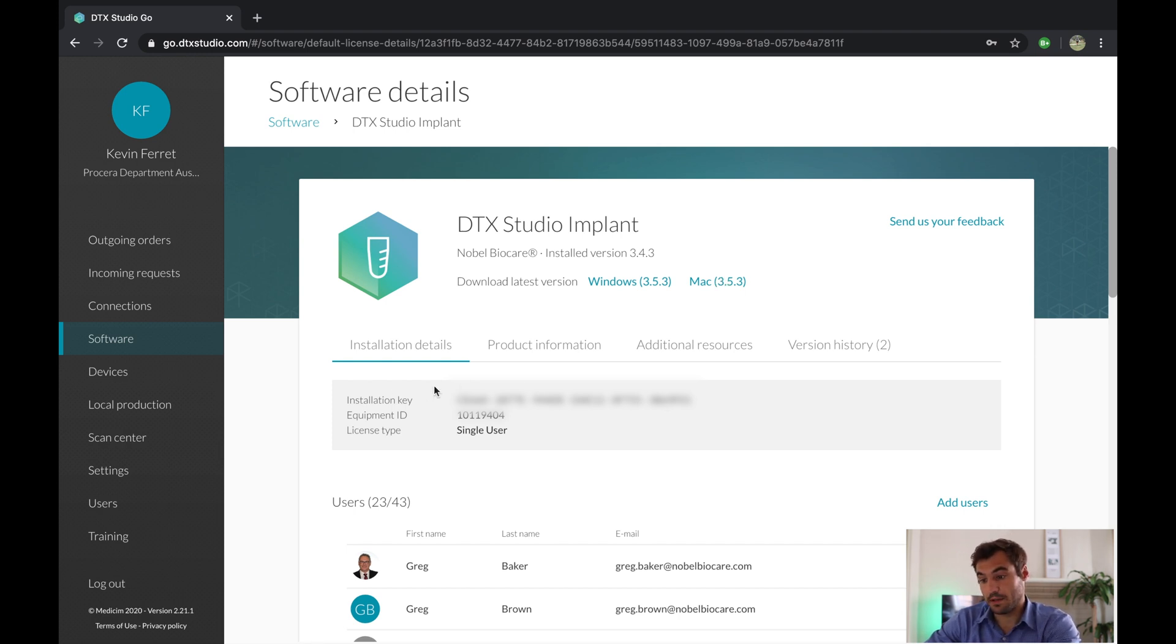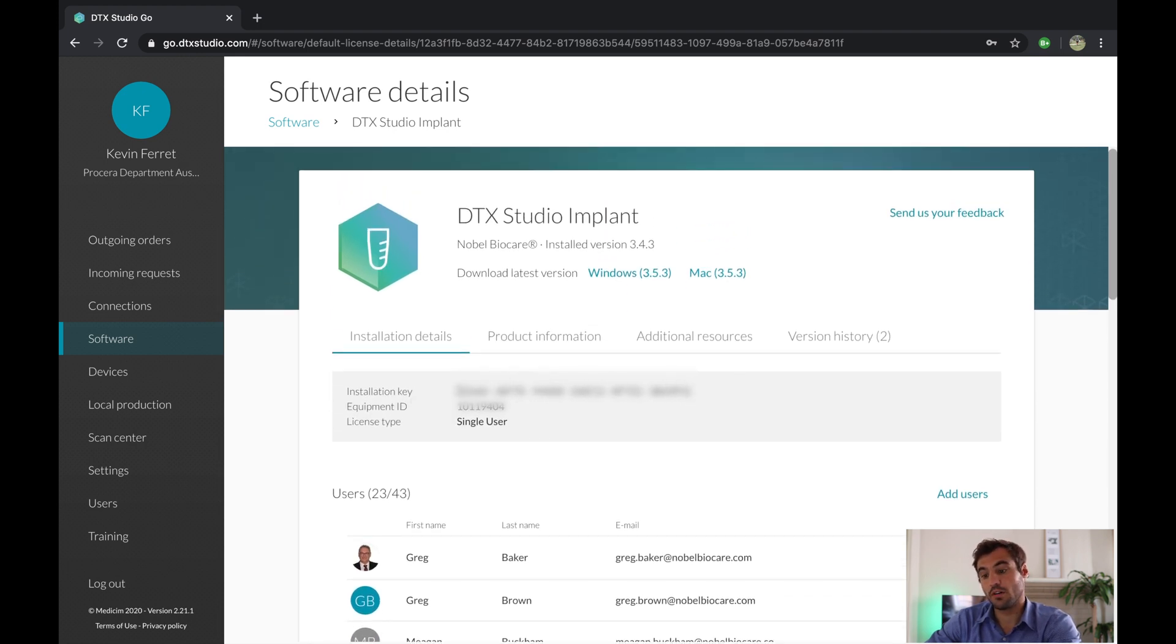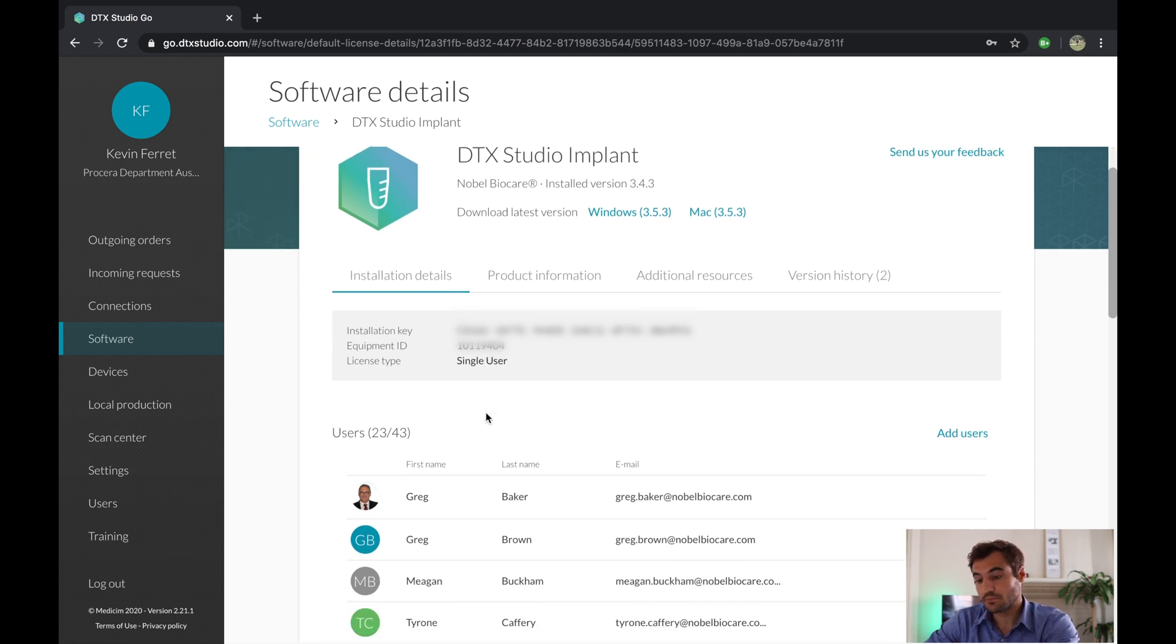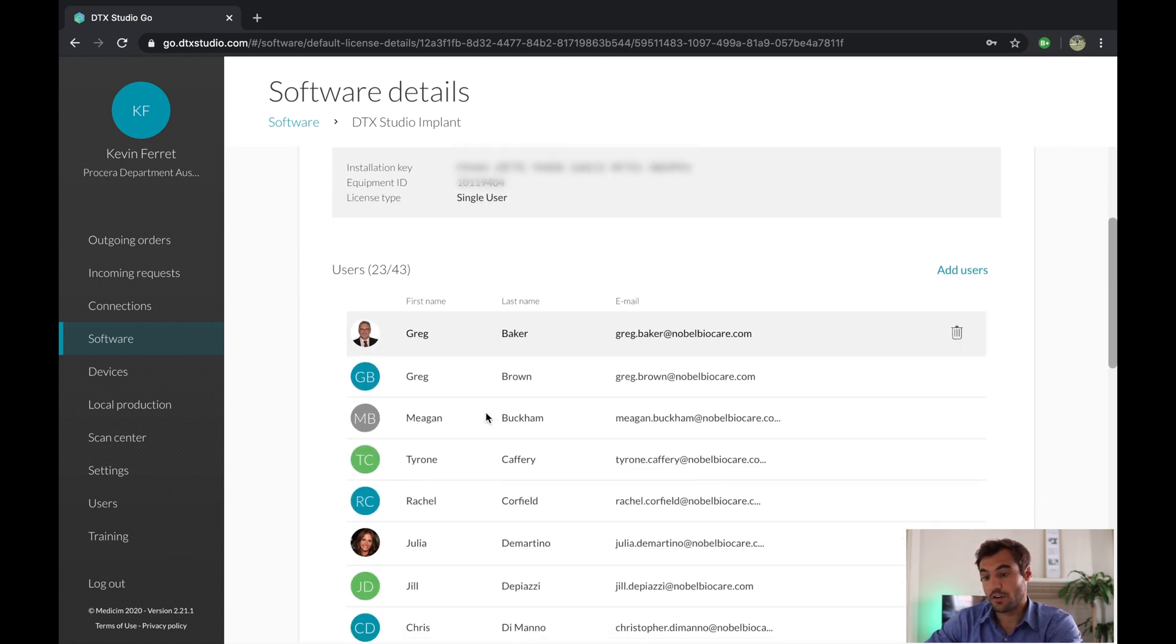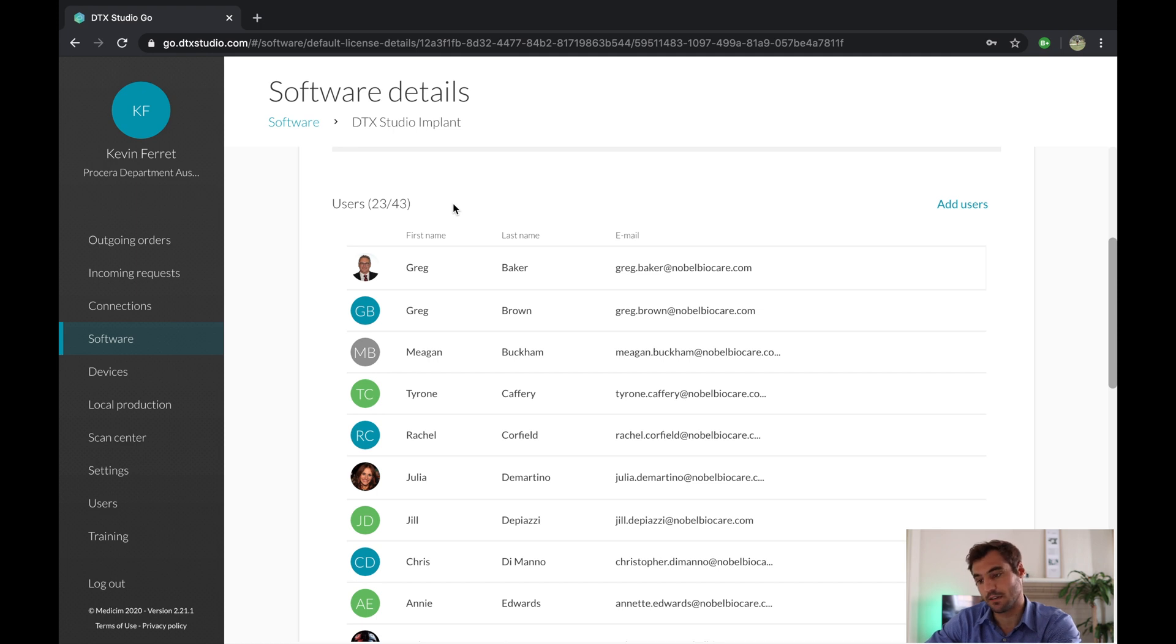Then below that you can have an installation key, which will be your installation key and equipment ID. Only this. You're going to have the amount of users, so the amount of users depends on your license. If you're on a practice license or a single license, for the single license you can have up to two or three users on top of my head.